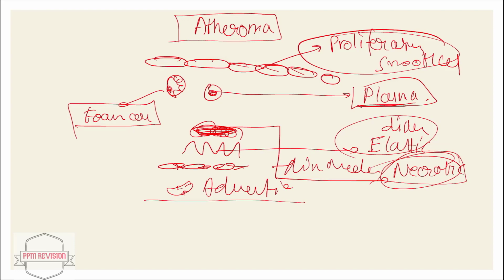So now we have done this. Let's look at some points, that is atheroma of the aorta in specific. There's a well-developed atheromatous plaque bulging into the lumen of the aorta, and there is deeper in the atheromatous plaque.